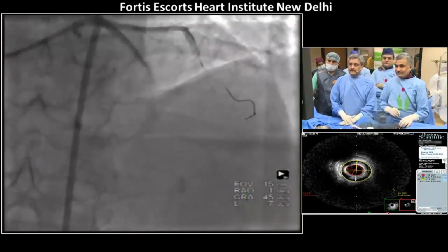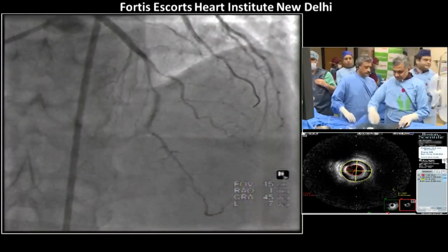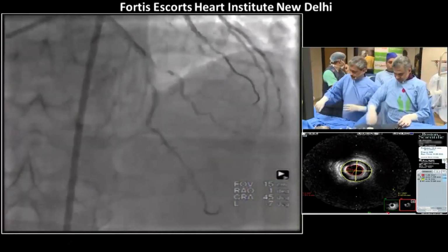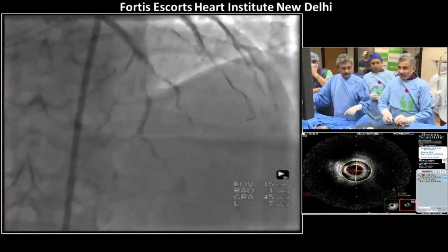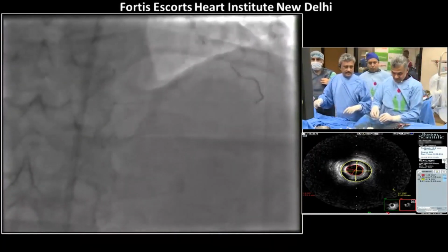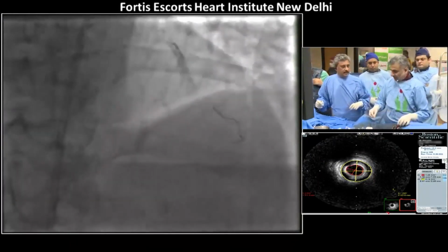This is Dr. Asadullah Hassani. I want to ask a question regarding if the LCX stent develops stent thrombosis again, what should be the choice after that? I think it's a very difficult question to answer because she might be having a repeat episode of thrombosis. And I think we would have to manage it medically now. You can't go ahead again and again.